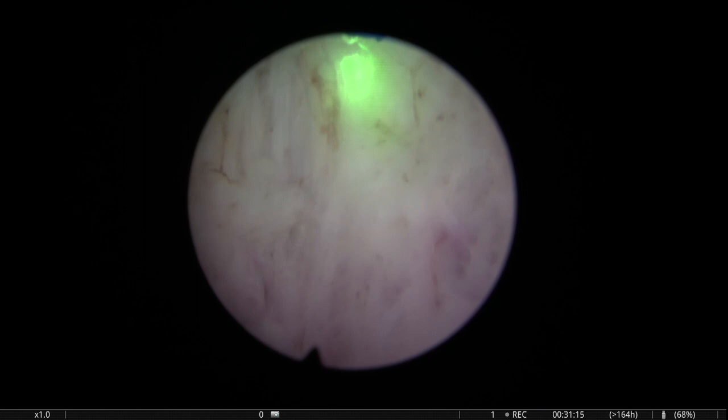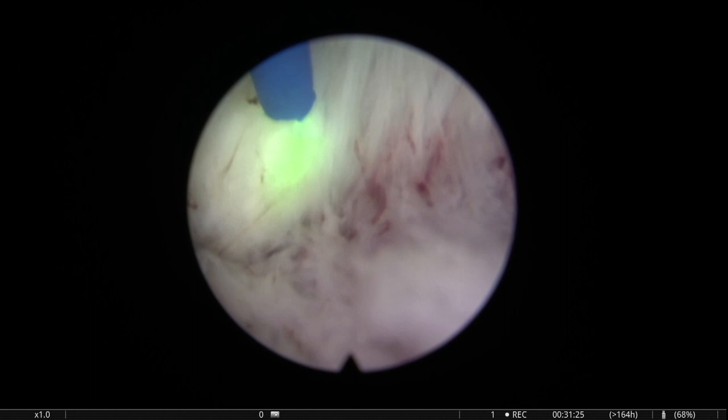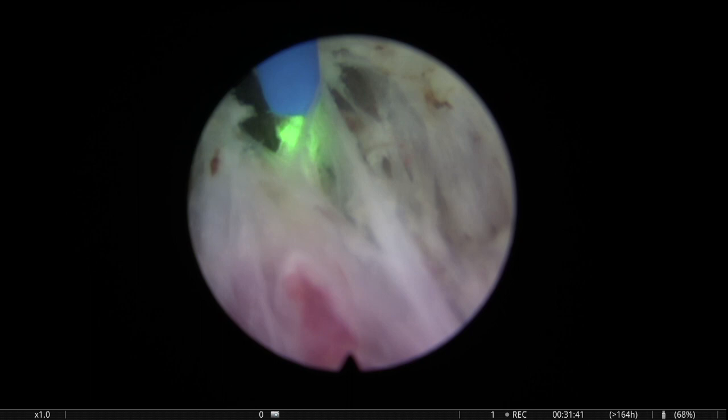It is logical. It's like, how do you call them? These guns, the repetition guns, the machine gun. So this laser is now firing. As I said, 18 bullets per second.